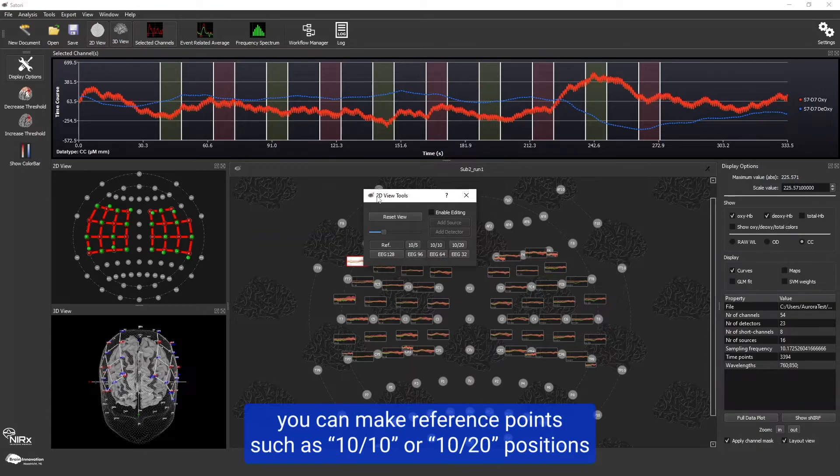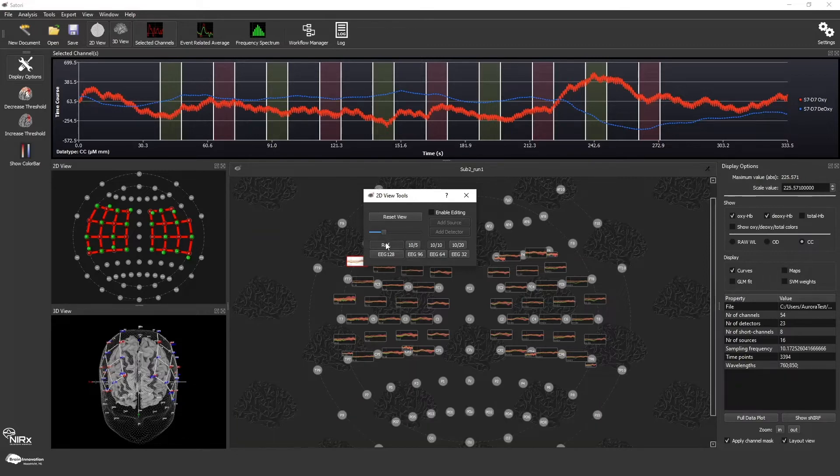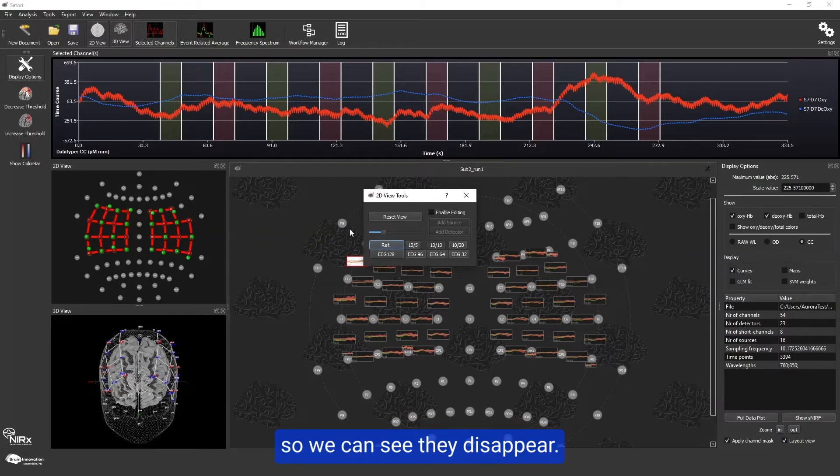you can make reference points such as 10-10 or 10-20 positions appear or disappear from the 2D view by clicking on ref. As we can see, they disappear.